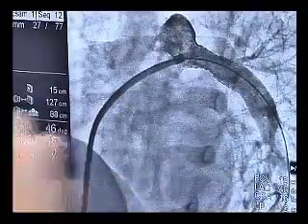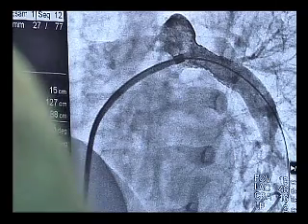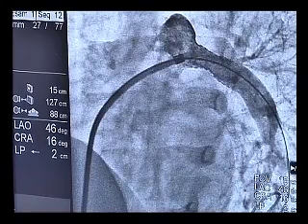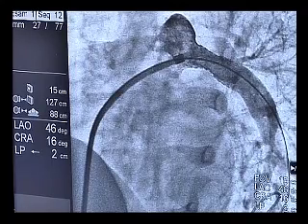Just a few minutes. All right, you're going to further dilate that particular stent today? No, we do not use to pre-dilate this stenosis. Unless it's native stenosis, we try to dilate with the cutting balloon. Otherwise, if it's post-surgical stenosis, we go straight to the stent, pre-mounted or not pre-mounted.